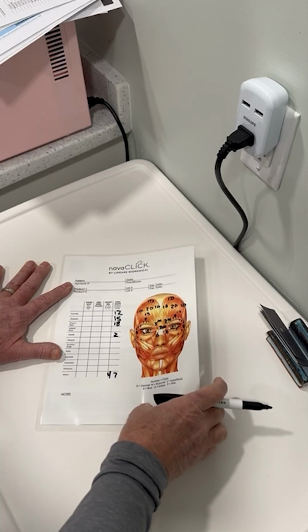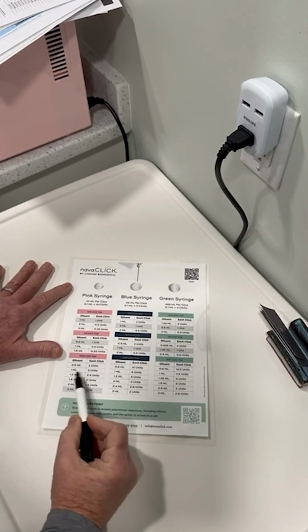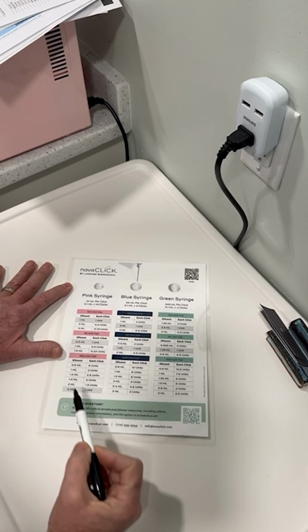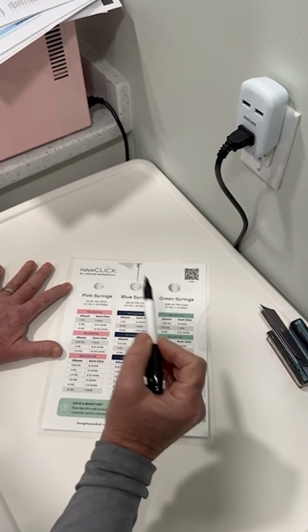Now the great thing about this is now that we're charting in Botox units, and we have 3 different syringe types based on your dilution. If you have a 1 cc dilution, we can create 1 unit per click. If you have a 2 cc dilution, you can create 1 unit per click. If you have a 2.5 cc dilution, 1 unit per click.